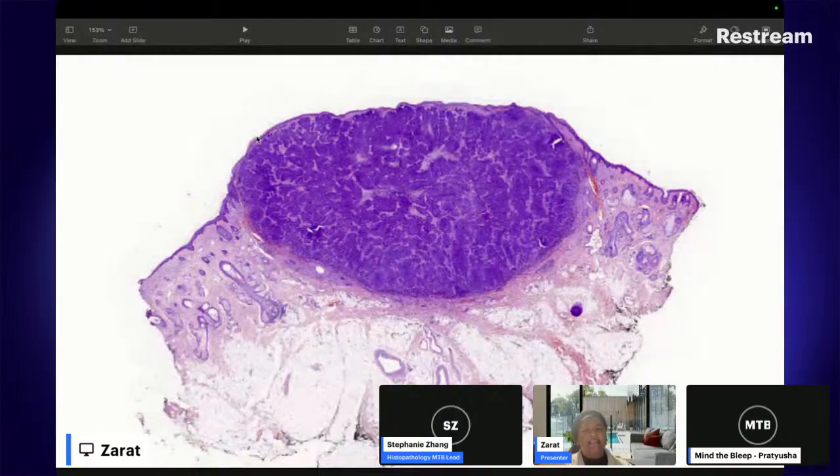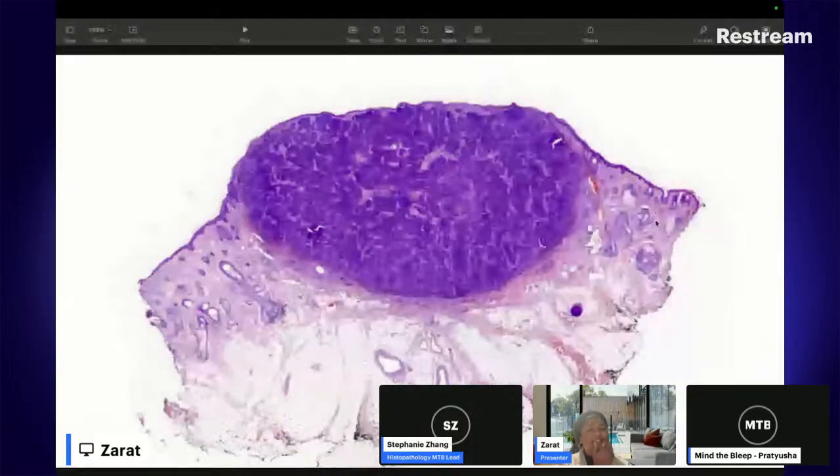And then in terms of where the abnormalities are, I think we have a very big abnormality here in the dermis. Is there any solar elastosis? If you look at these areas, which look more purpley, bluish, we do have sun damage as we expected. What cells are these?